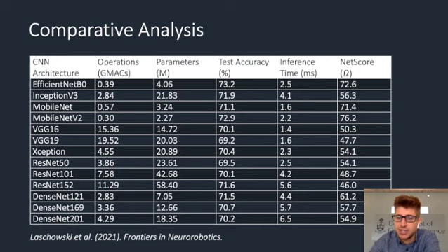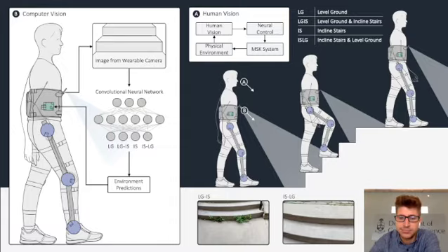smaller series of locomotor activities. And so we started with stair recognition because it presents one of the greatest safety risks to older adults and/or rehabilitation patients.